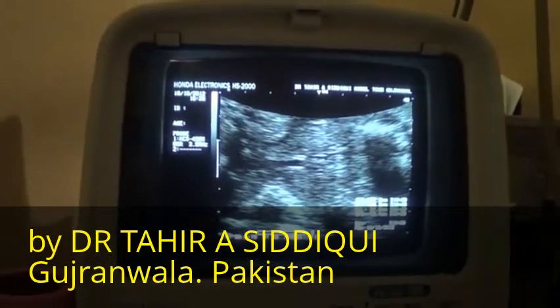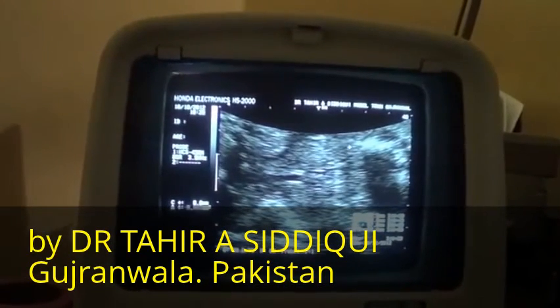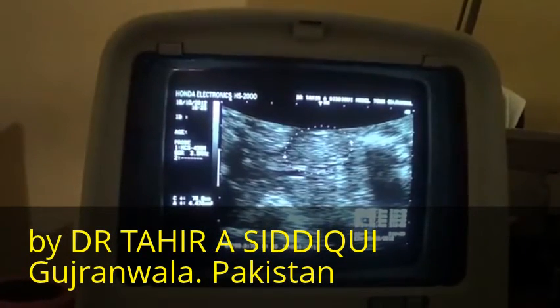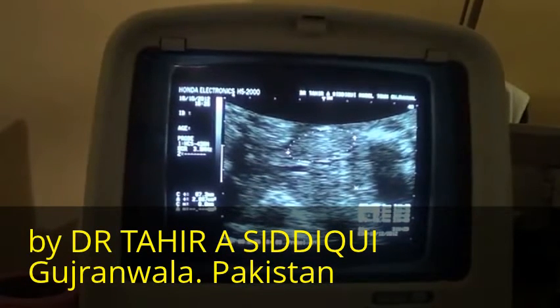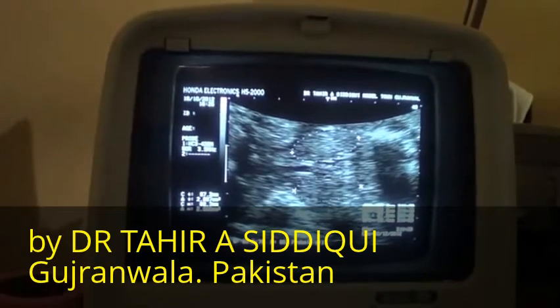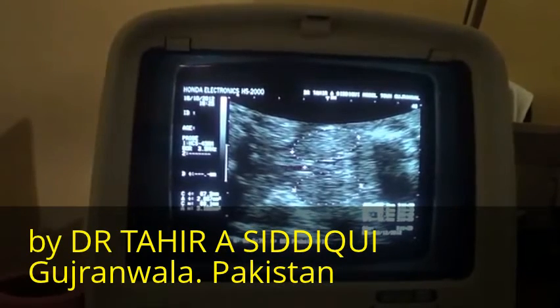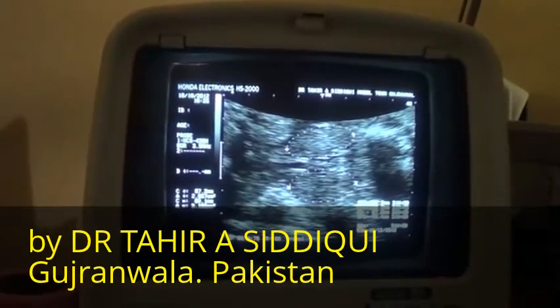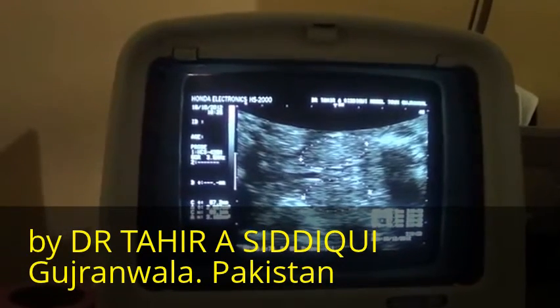Now you see this is the evenly echogenic bilobed mass with a vessel in the center of it, passing through the center. This is the main vessel, and to me, if I am not wrong, it appears to be the superior vena cava.